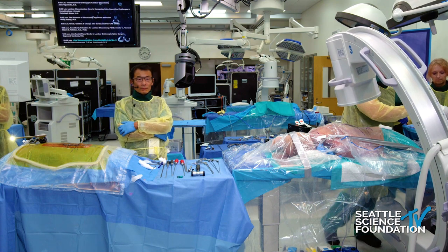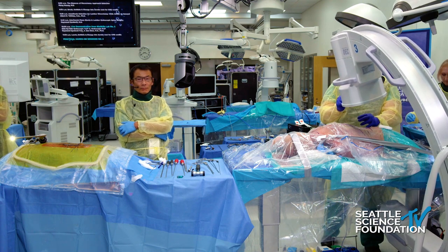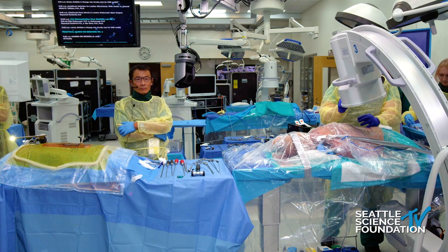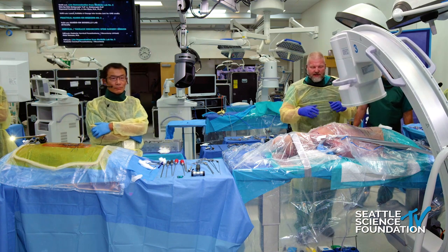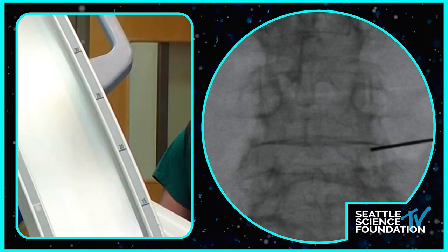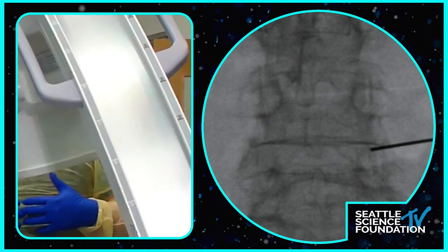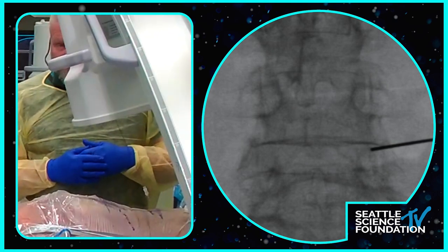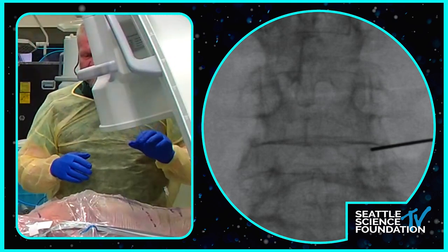Just back the scope up a little bit for me so I can get underneath here. So Ray, you're not doing a foraminoplasty at this point, right? You just go direct into the canal. Well, you could ream it if you want, but like I said, I don't normally use reamers. I like to put the scope in and identify my exiting root. If I'm going to do a foraminotomy, I do it with the drill under direct visualization. And you do it awake, right? Yes, all of my transforaminal stuff I do awake.